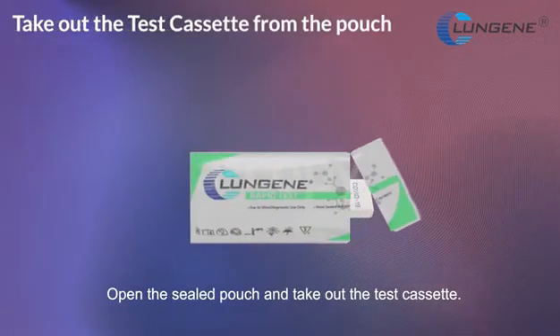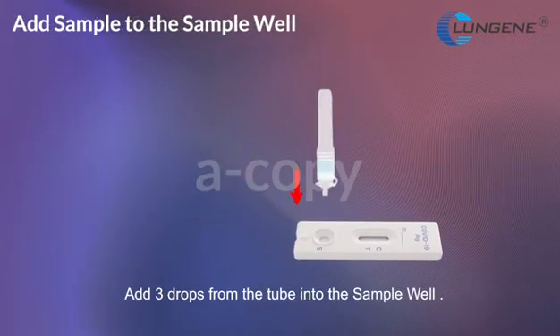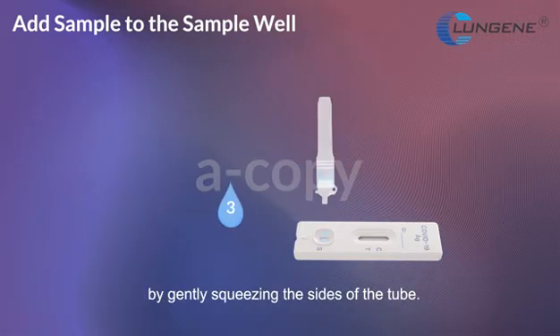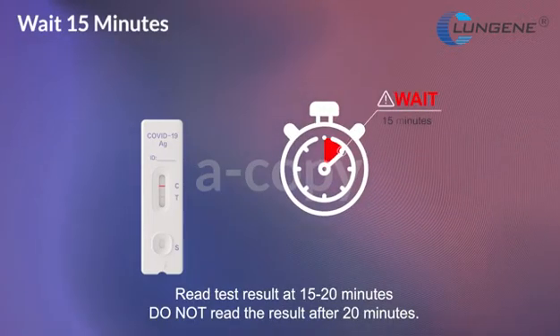Open the sealed pouch and take out the test set. Hold the tube vertically over the sample well, not at an angle. Add three drops from the tube into the sample well by gently squeezing the sides of the tube. Start the timer. Read the test result at 15 to 20 minutes. Do not read the result after 20 minutes.